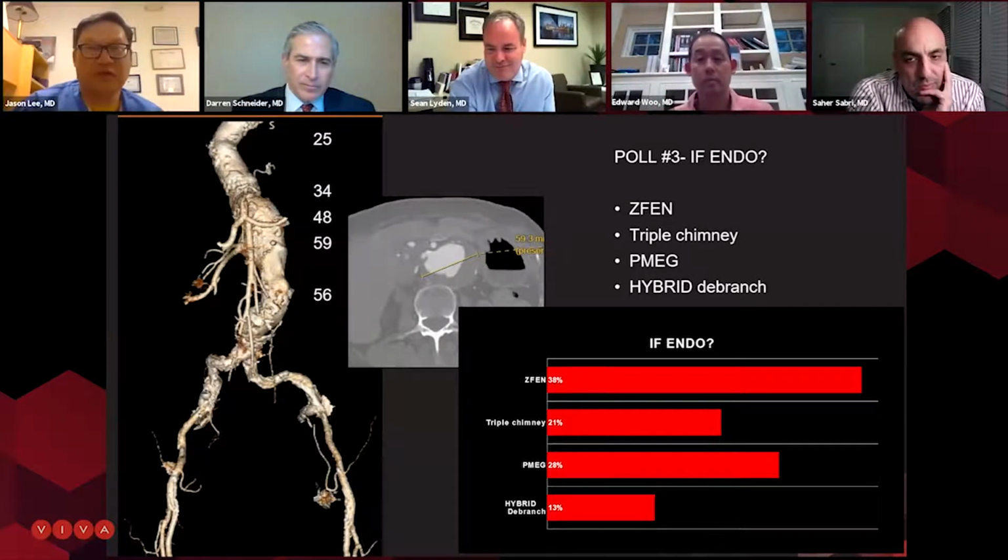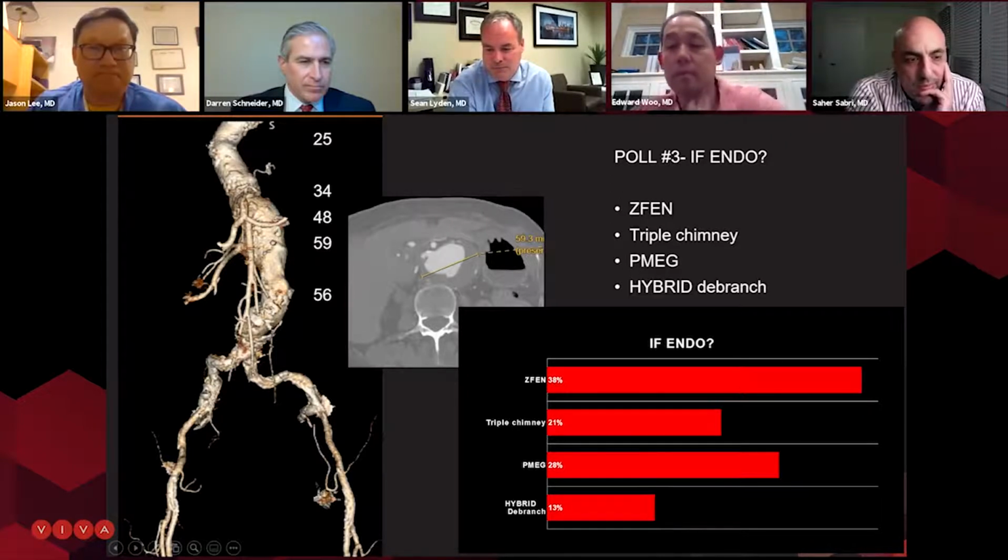Okay, question 3. Now if we're choosing to go down the endo route, those of you that know me know we went down the endo route. Are we going to try to build a fenestrated device, do some sort of triple chimney, modified device, and or IDE, I guess? I should have put that as a choice, and hybrid, or a hybrid debranch. So I guess since I know who our panelists are, Darren has the IDE. So while we had the IDE, that's always my choice. And then all of a sudden, when Matt Eagleton went to Mass General and I lost the IDE, your choices all of a sudden changed. And so I wonder for both Ed and Jason and Saher, for your own institutions, when you guys don't have IDEs, how are you guys working on it at your institutions?